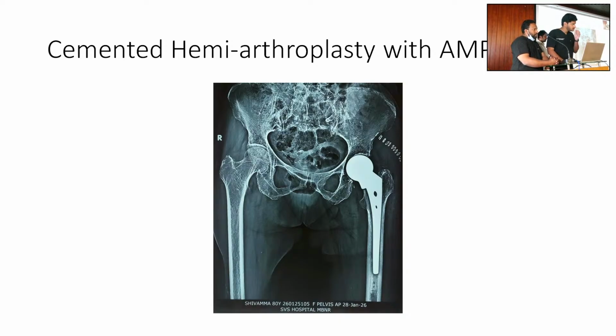But is cement used here? Cemented, sir. Or proximally it's there? It's not there. Distal cement. Is the calcar intact or split? Calcar is split now.